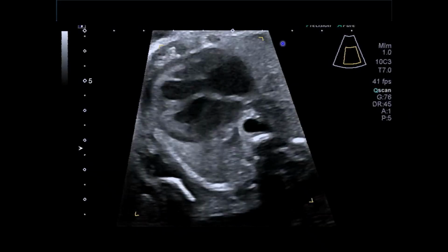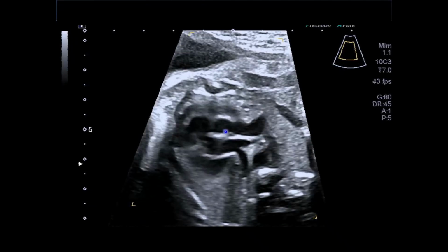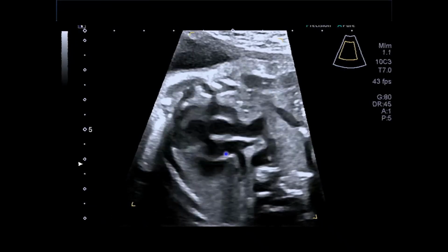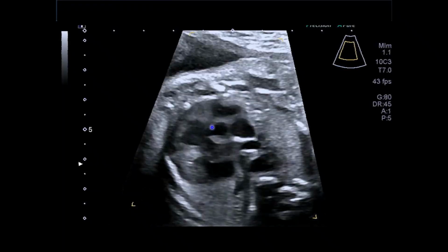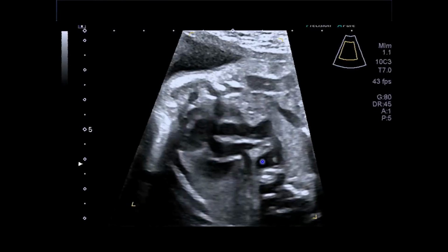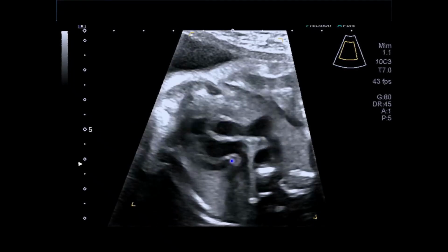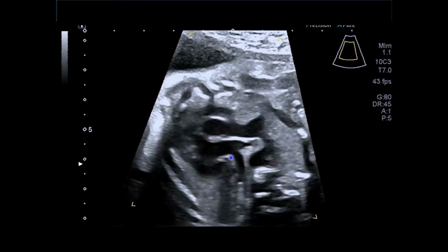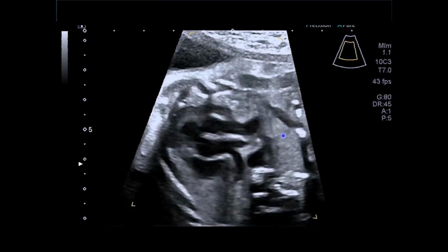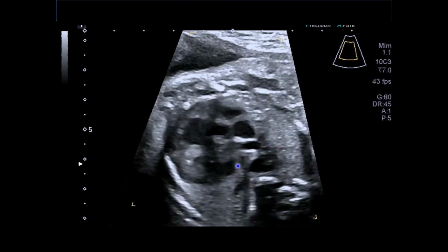And so in this example, we have a 4-chamber view. This is left and this is right. It's slightly oblique, but when we transition into the upper chest, we're starting to see this is the pulmonary artery here, and this is the ascending aorta. This is part of the SVC. Here's descending aorta, and so this is going to be the course of the aorta. But importantly, you're seeing the trachea here. This is the RPA as it goes out to the right lung.